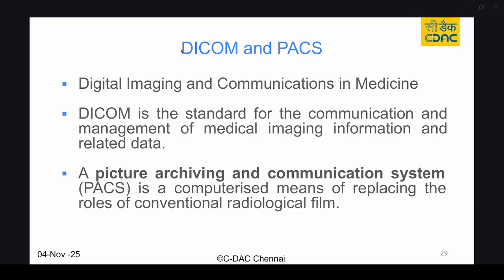As I said, DICOM is a digital standard, Digital Imaging and Communications in Medicine. It is a standard for representing medical imaging in the healthcare sector. Most of the current X-ray machines use a picture archiving and communication system. It is a computer means of replacing the roles of conventional radiological films.